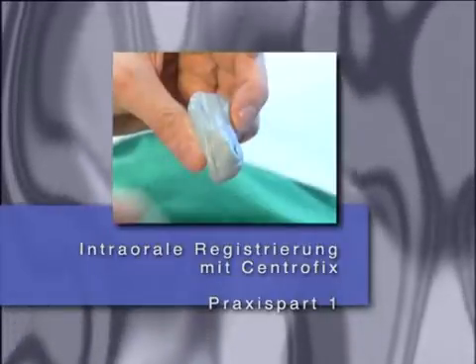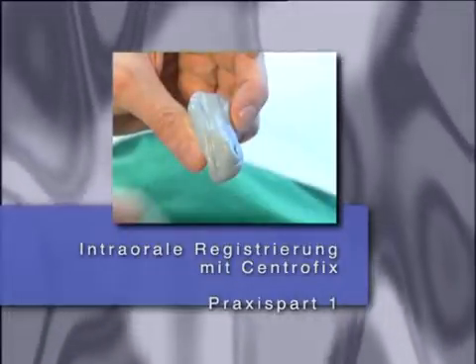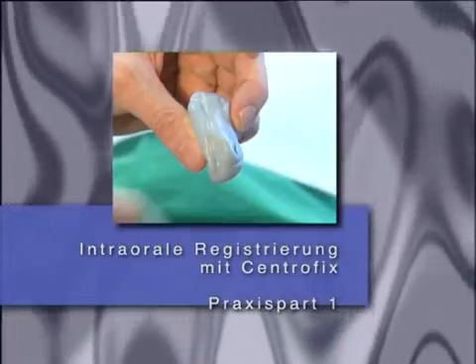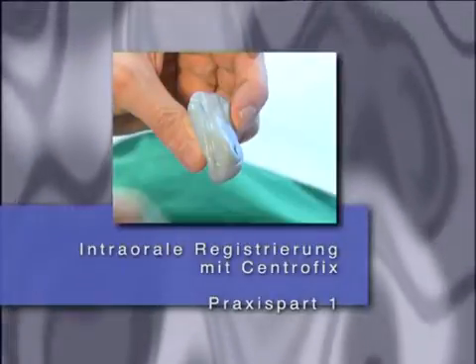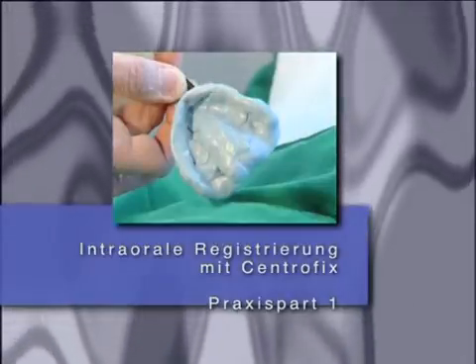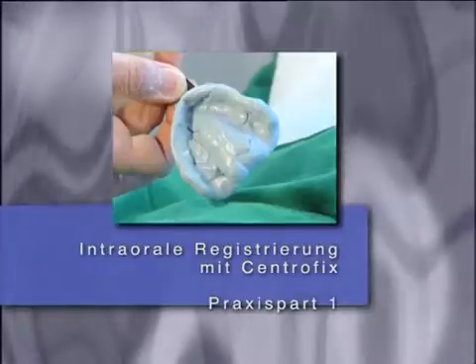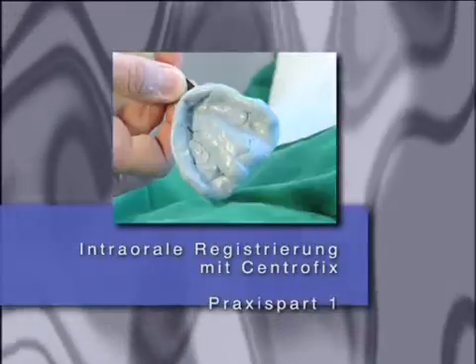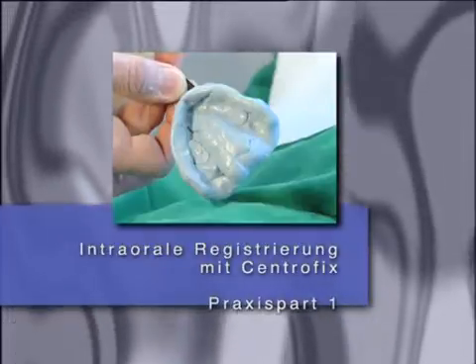Intraoral bite registration using a Gothic arch system is only one piece of information from an entire chain, that is, the relationship of the mandible to the maxilla, bite registration, which is particularly difficult when the teeth are missing. Dr. Lutz Centrofix makes use of the entire information. It requires certain procedures in the laboratory before and after treatment. We are going to begin with the preparatory procedures in the dental practice with which the technician integrates the Centrofix instruments into the functional tray.